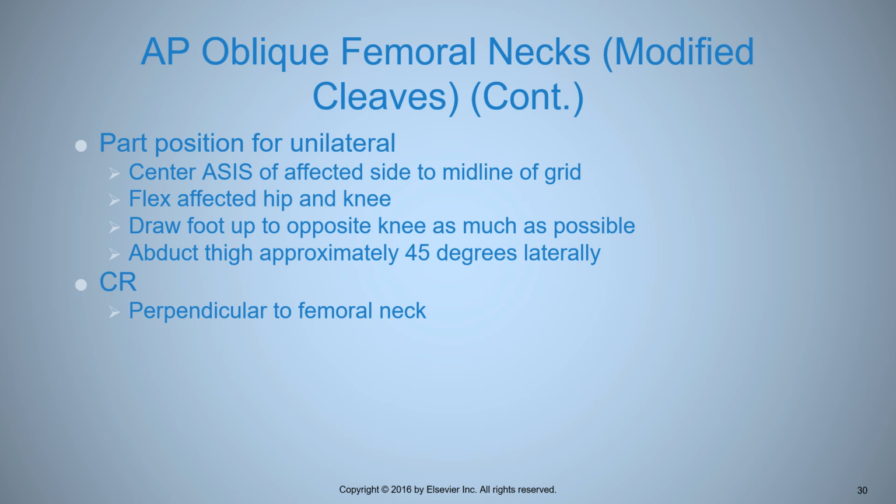If the patient is able to frog, then you should be able to detect the crease that marks the hip joint. Typically, the vertical plane is going to be right along the ASIS. So draw a line down vertically from the ASIS, and that's where the vertical targeting line is going to be. The other targeting line is about the level of the greater trochanter, and that'll get you to a good center for this.